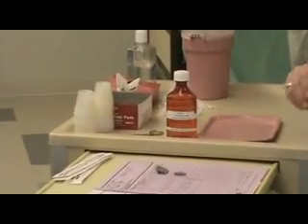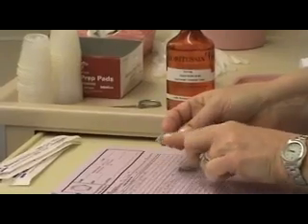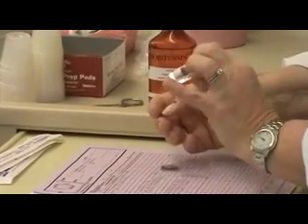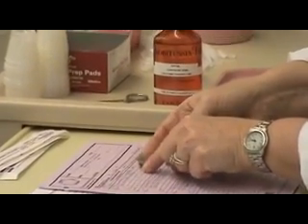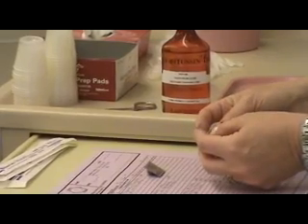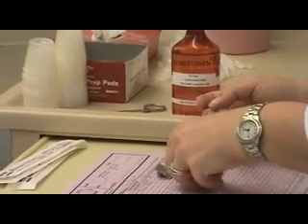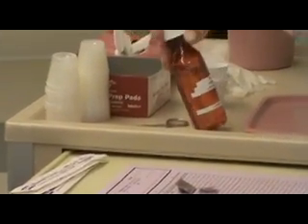Now I'm going to do my second check. I'm going to take a look at my diazide again, making sure I've got the right drug, the right dose, of course it's the right route, and the expiration date is what it should be. We've got our warfarin, right dose, right expiration date, it's a tablet. And we have our liquid medication here.